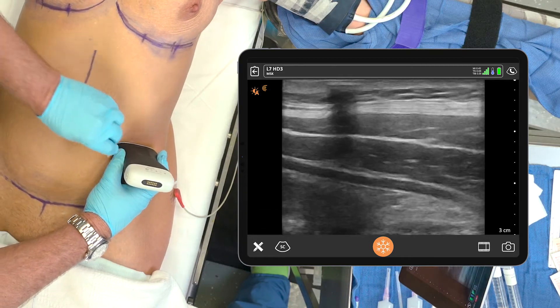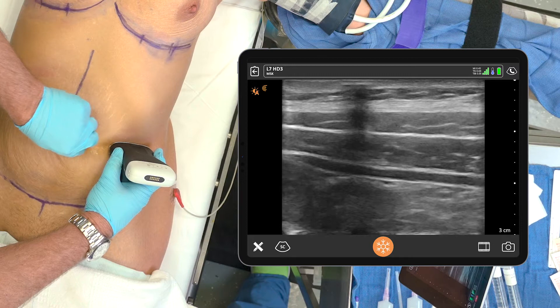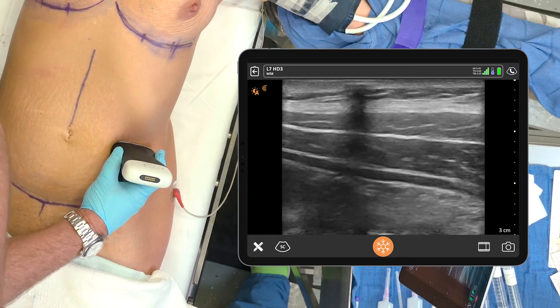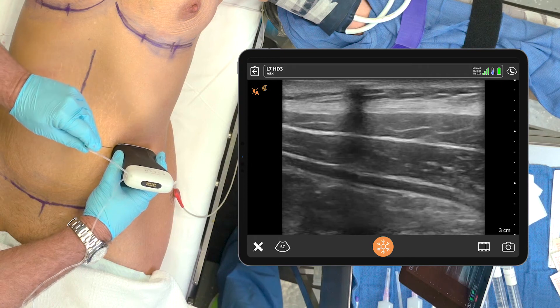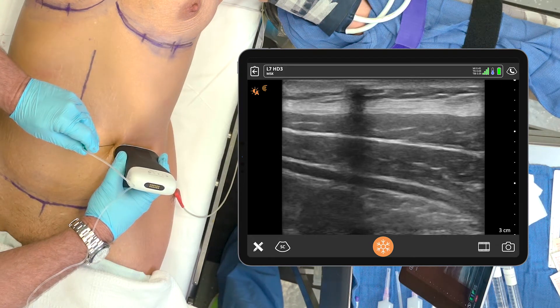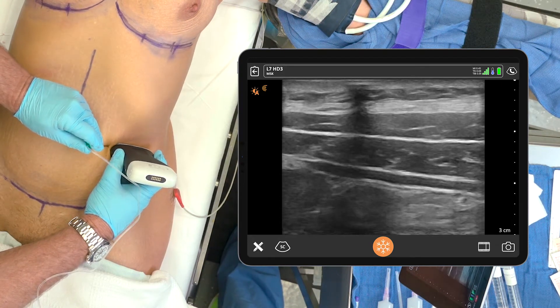There's my view — a nice view of all three muscles. For this, we're going to use a mixture of 20 cc's of saline, 20 cc's of Marcaine half percent, and 20 cc's of Exparel.